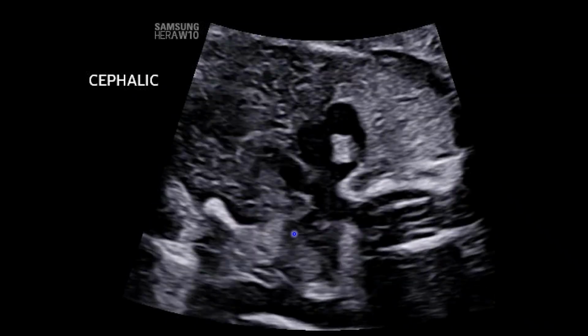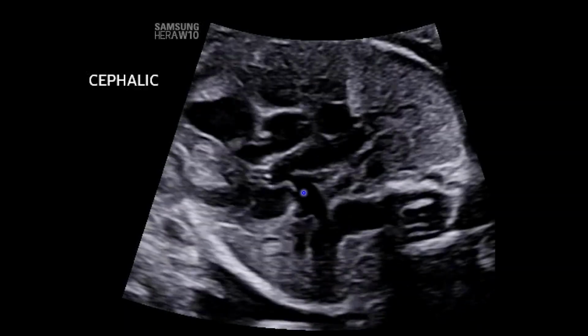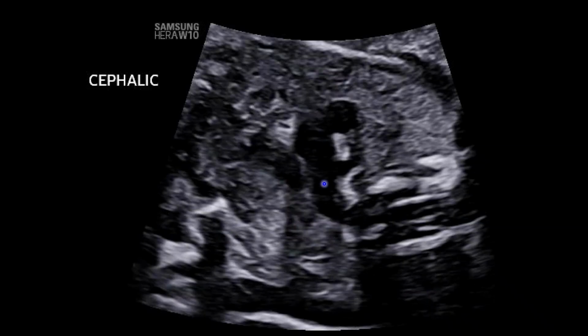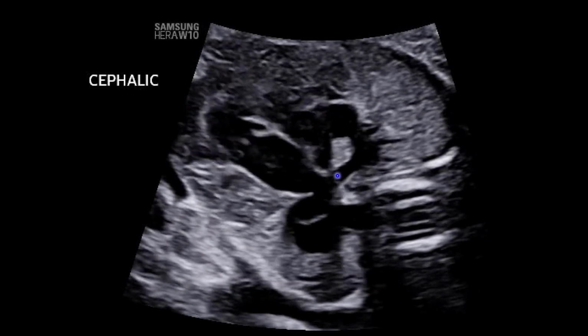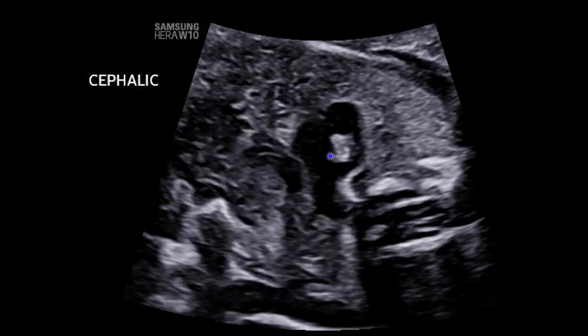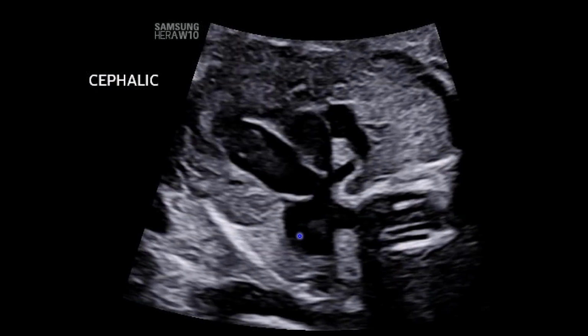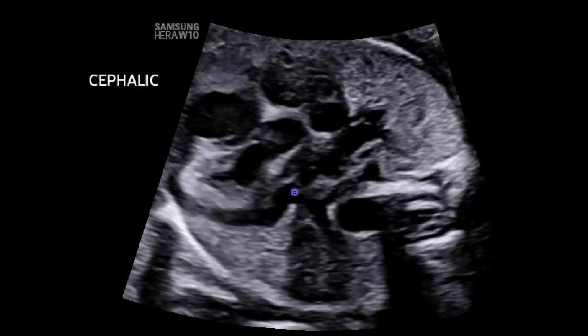It takes this curve, two acute curves here, and then comes back to the descending aorta. There's the transverse aortic arch, and right here is the trachea. And so both the aortic arch and the ductal arch, although very tortuous, are to the left of the trachea.